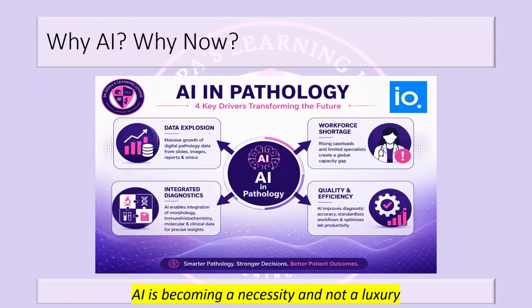So just for a diagnosis, let us say there is some growth disorder in a child. You just can't rely on one liver biopsy that you get. You don't rely on just that. You rely on a multitude of data. So that is why there is too much pooling of data. That's the first trigger for AI development. Then second, each patient generates far more information than before, correct? So right now that is the challenge that we have to look at.